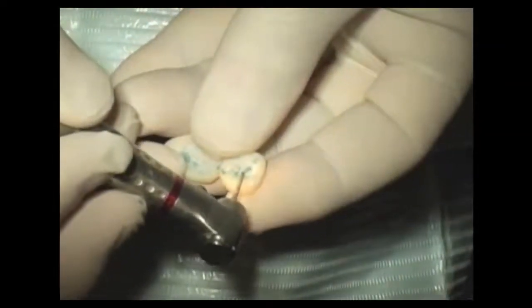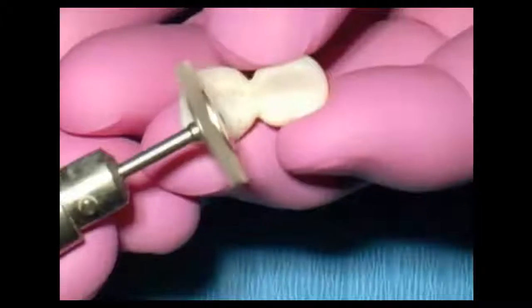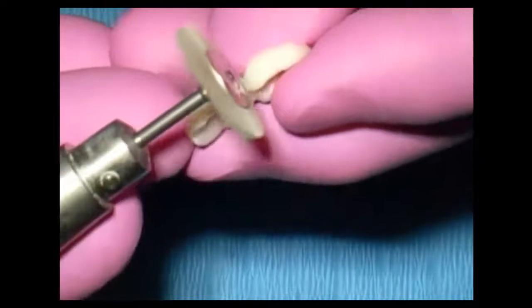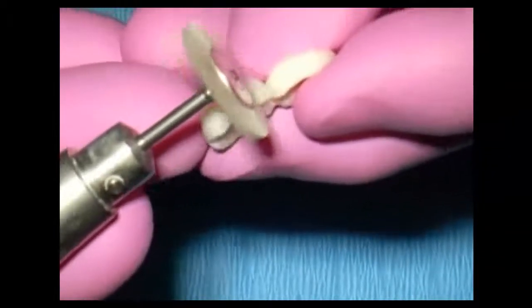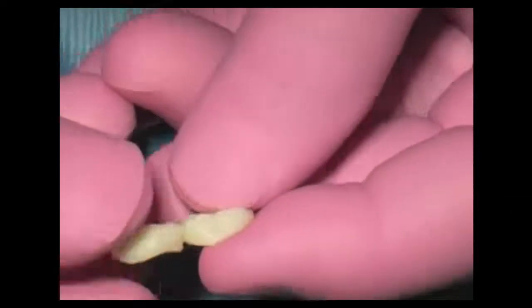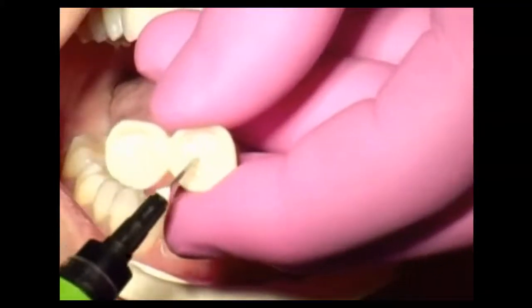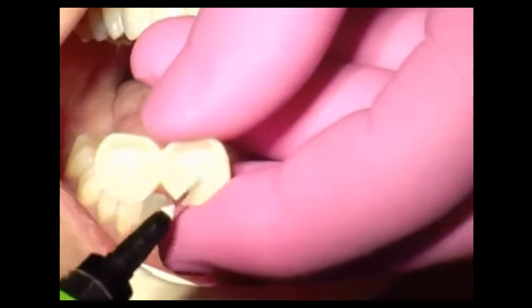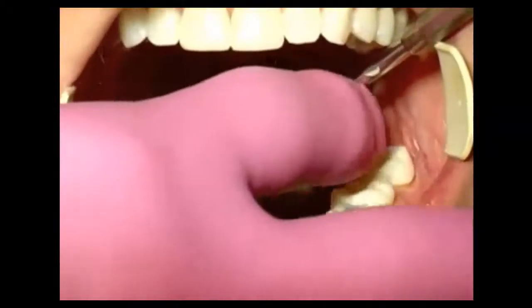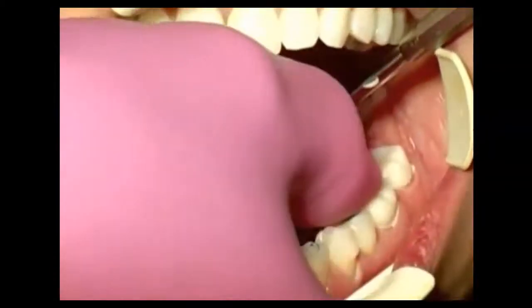What's used in the preparation of the teeth is going to be a high-speed handpiece with the diamond burrs, because remember, diamond burrs are going to be more abrasive, which is going to allow for a lot more tooth structure to be removed. In this case, rather than separating the crowns since they were right next to each other, the dentist decided to leave them connected, which is going to make them a little bit more stable than if he were to have separated them and done them separately.